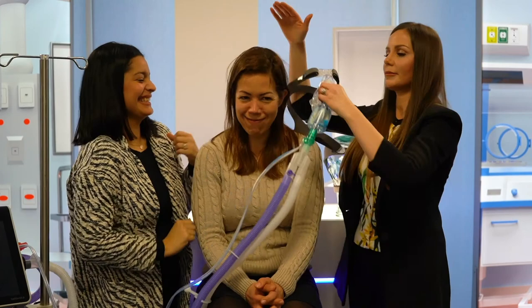So tell me, you were the patient. How did that feel? And did you think it was comfortable? Yeah, it was comfortable. It was harder to breathe, obviously, because I didn't have the flow. No, and it didn't have the anti-asphyxiation valve. It wasn't entraining any room air.